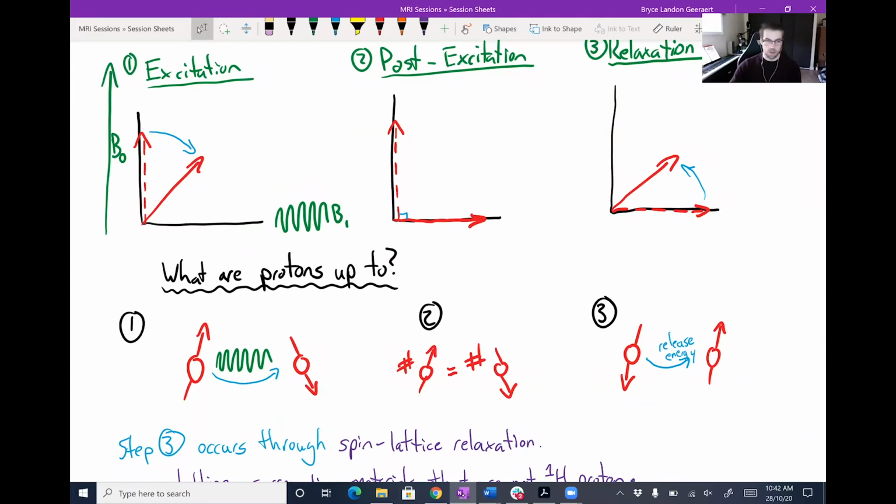But when I talk to some people about why this is the case, when I was preparing for my defense, I got some nuggets of wisdom that, at the actual quantum level, which again is beyond the scope of this course, when you consider quantum mechanics, there's more of a continuous distribution of hydrogen atoms. It's just that they return to these up or down states, so they're biased towards being in these states. And there's hydrogen atoms doing all kinds of crazy stuff in the body all the time, is really the main takeaway.